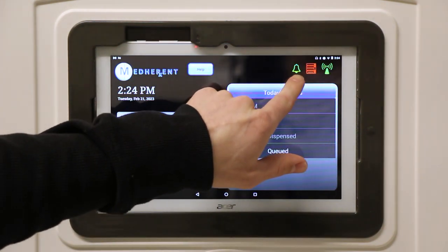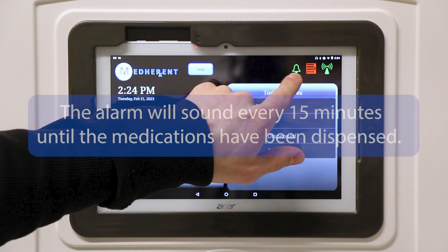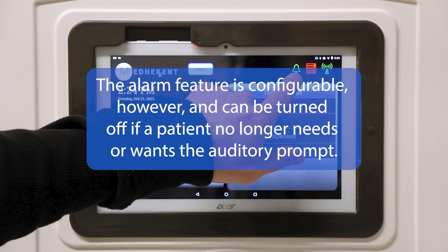This icon indicates whether or not the alarm is activated. Right now it is green, which indicates that the alarm is on. This alarm, which sounds like a soft chime, is used to alert patients and staff that medications are available to dispense. The alarm will sound every 15 minutes until the medications have been dispensed. The alarm feature is configurable and can be turned off if a patient no longer needs or wants the auditory prompt.